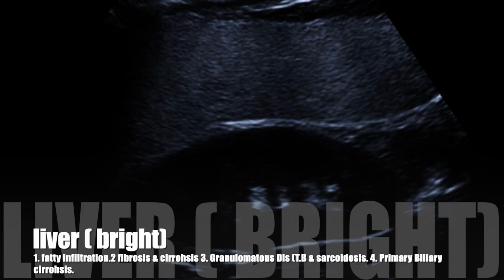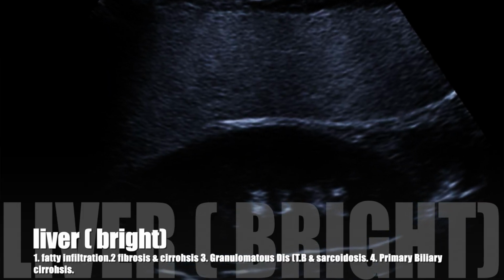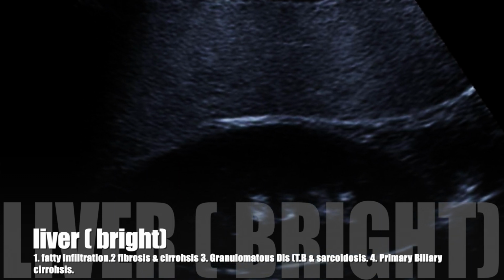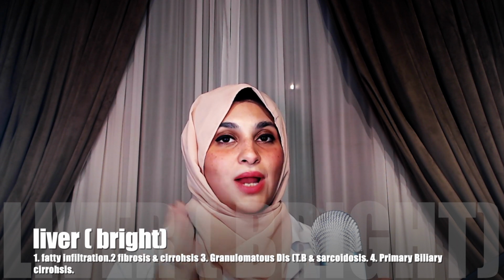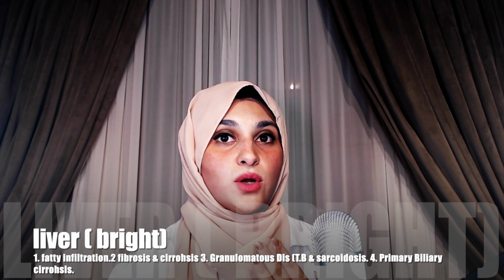Diffuse liver diseases in which the liver will appear brighter, as in echogenic, are number one, the fatty liver disease. Number two, the liver cirrhosis or fibrosis. Number three, granulomatous diseases such as TB and sarcoidosis. Number four, primary biliary cirrhosis. So these are the four diseases in which the liver will appear diffusely brighter or echogenic.